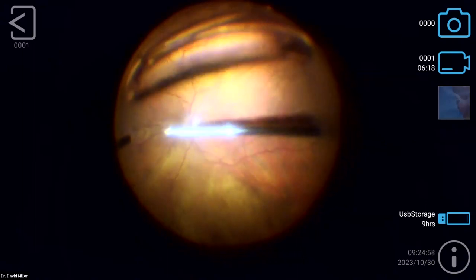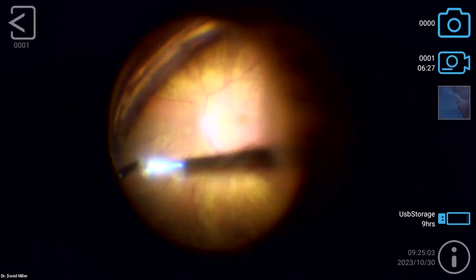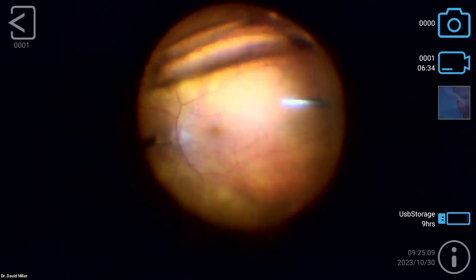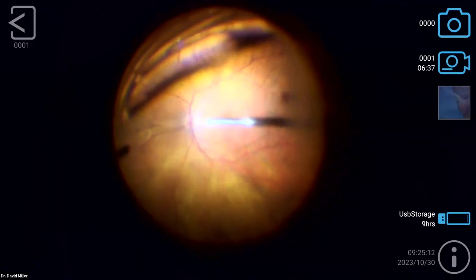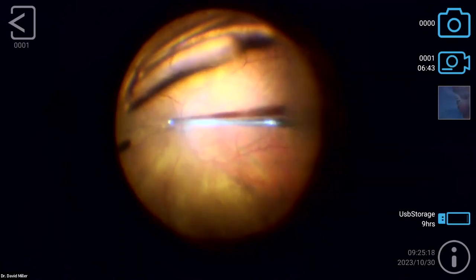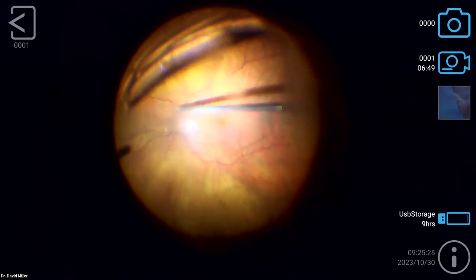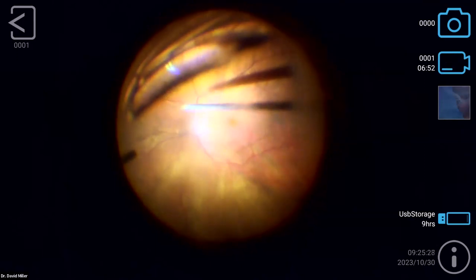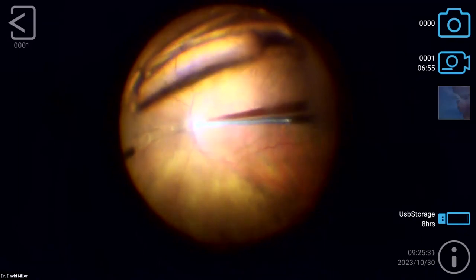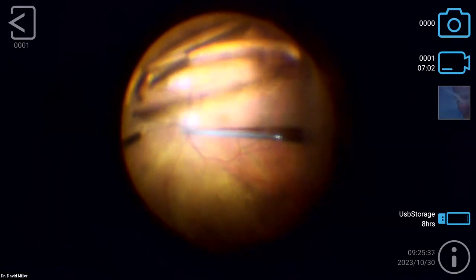And that includes even a vitreous separation, ideally. And I'm not really worried about the lens implant falling here. I want to make sure it's not entangled. That's more important. If it falls, then I know it's free of entanglement. And we're going to try and make sure there's no vitreous remaining back here. Typically, there is not, but here there is. The vitreous is still attached. So I'm using the aspiration on the cutter to pull the Weiss ring more or less off the disc, try to engage it, hook it with the vitrector.